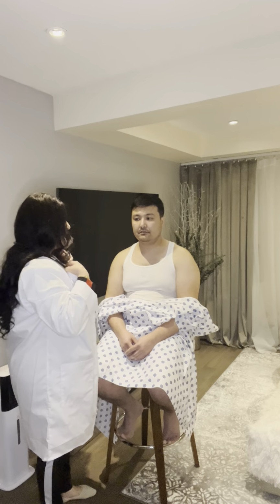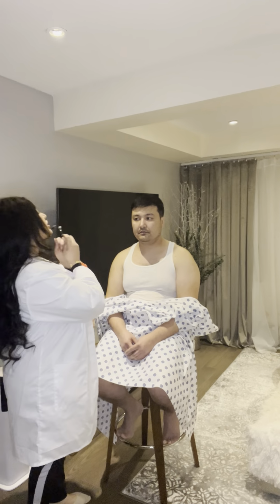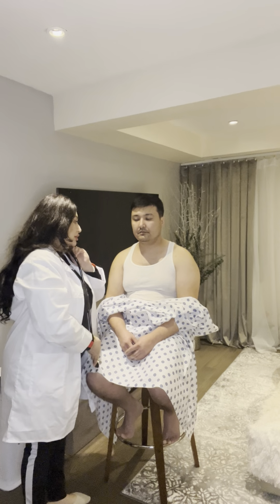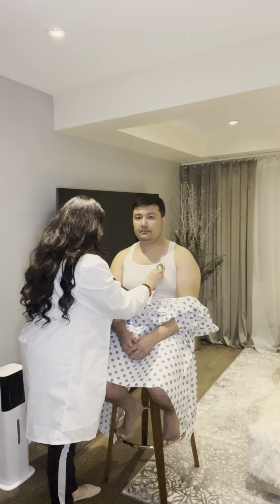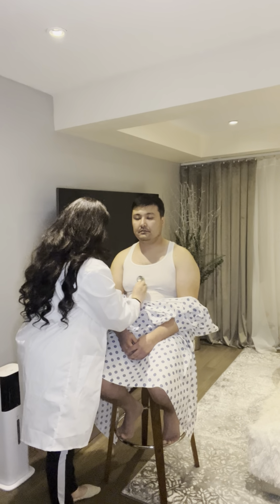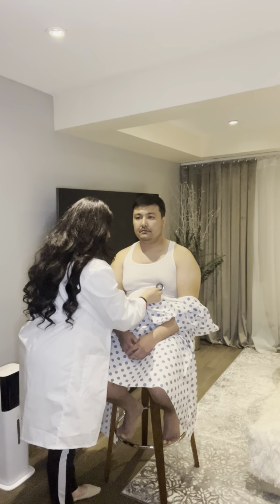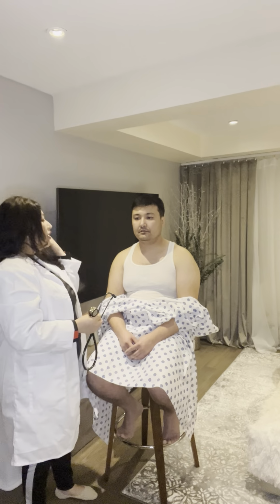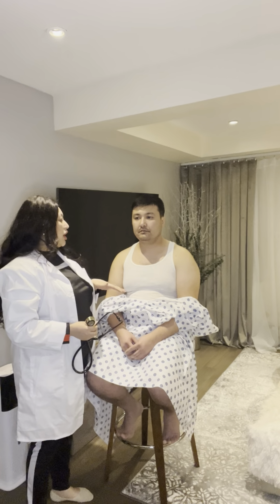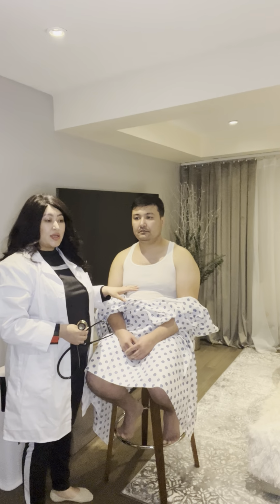Now I'm going to listen to the lungs. You're going to be breathing in and out, okay? Okay, lung sounds are clear bilaterally. No wheezing, no crackles. Now I'm going to move to the cardiac assessment.